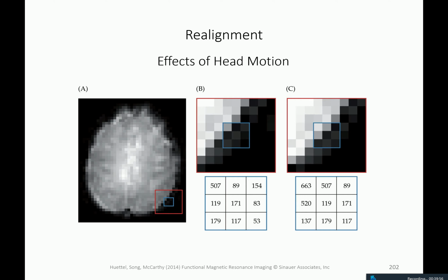If you have your brain in there, you do a couple of images over time, and then you move your head somewhere in the data grid where the scanner puts a certain sample, the data will be completely different. Of course, this is not what participants usually do.